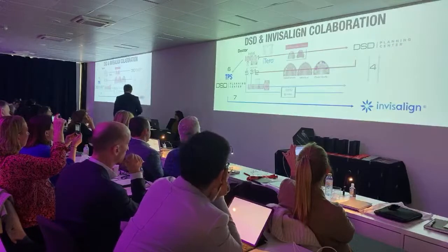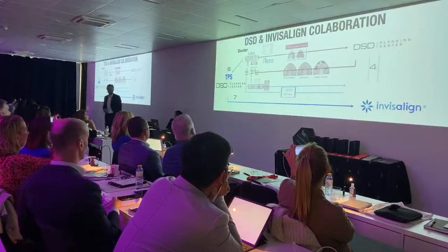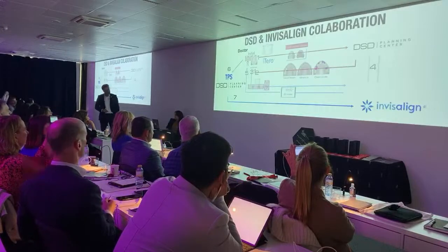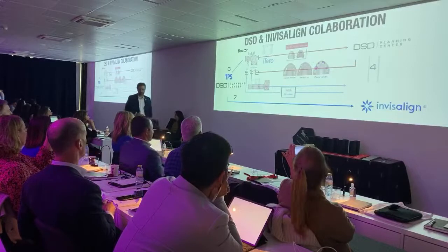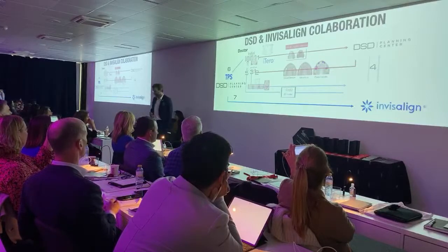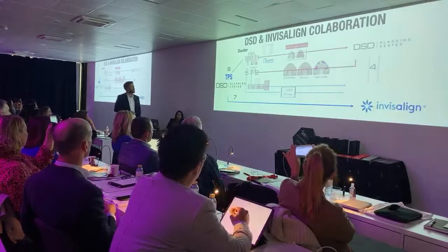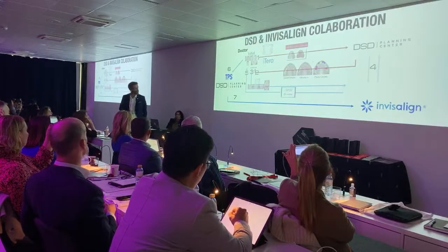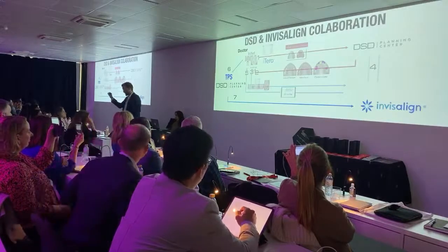And then this is when TPS gets into the game. Whenever we receive the ClinCheck, if you want, of course, that's not mandatory, it's up to you to decide, you can share this case with us through the TPS platform. I'm going to show a video that shows the steps.